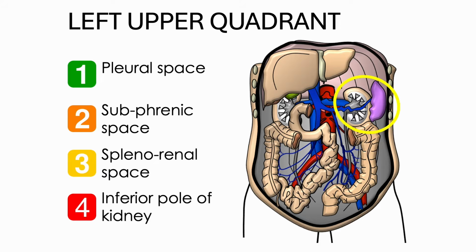However, some important points about the left upper quadrant should be remembered. Blood from a traumatic spleen injury usually is seen in the right upper quadrant exam first. Blood from an injured spleen will generally not travel down to the pelvis due to the phrenicocolic ligament, which extends from the large bowel to the diaphragm. And ultrasound is very poor at finding parenchymal injuries to the spleen.